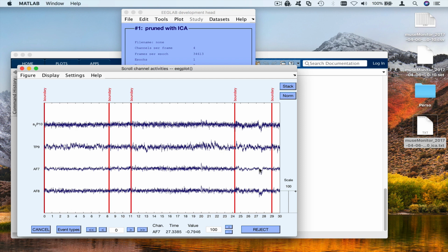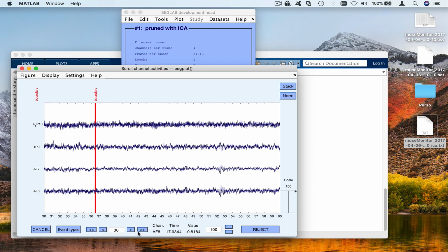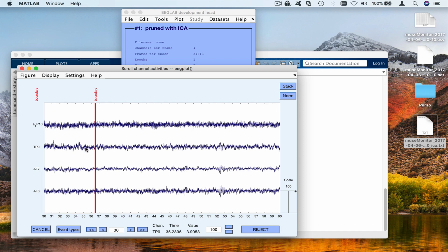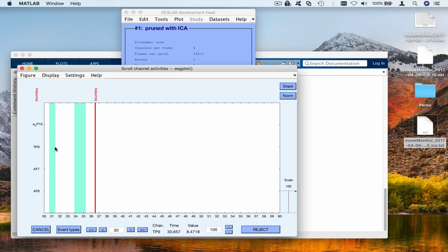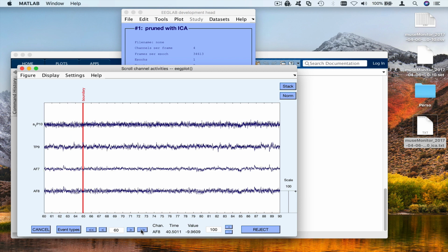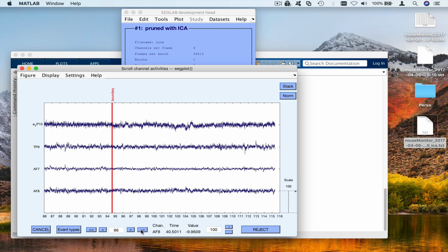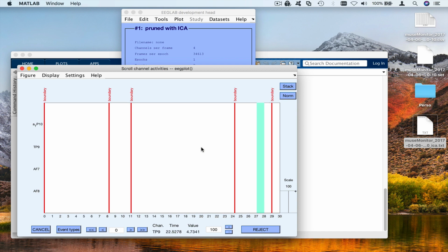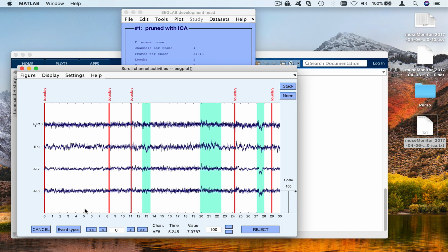Well, maybe here. Here, definitely an artifact, which I forgot to remove. Here probably this deserves to go. Here. I'd like to remove this as well. And this. Okay.